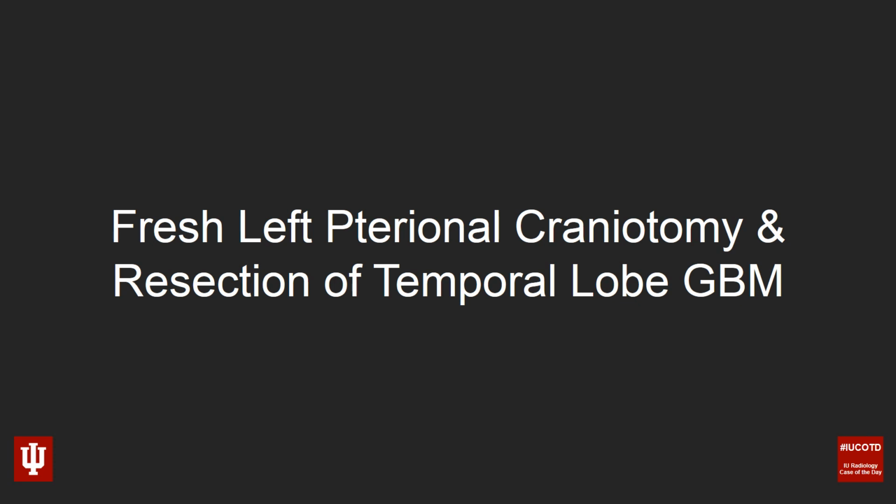So here's the history on this case. This is a patient who had a very recent left pterional craniotomy and resection of a left temporal lobe GBM, or glioblastoma.